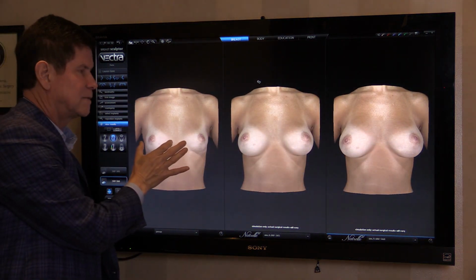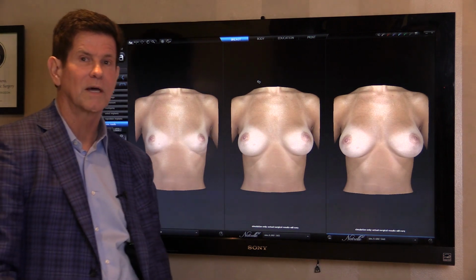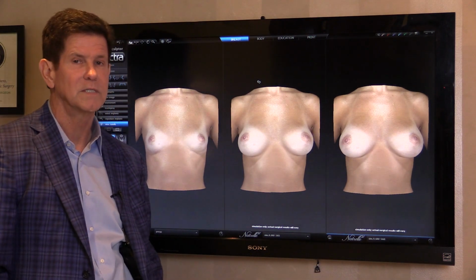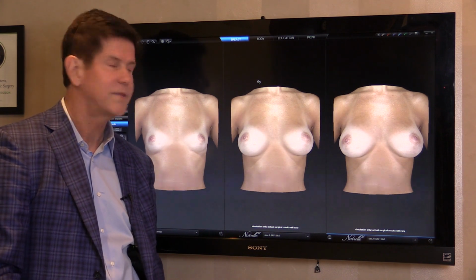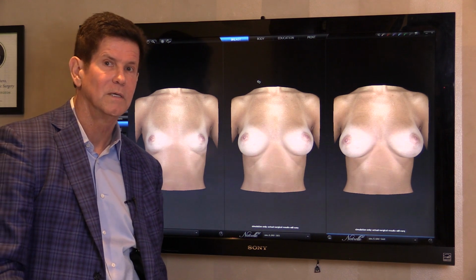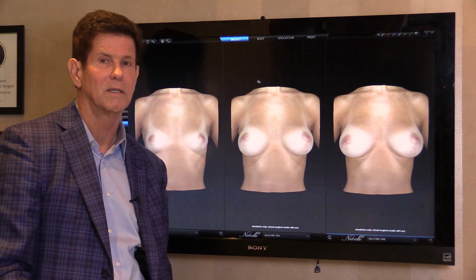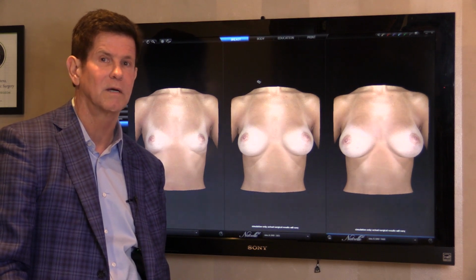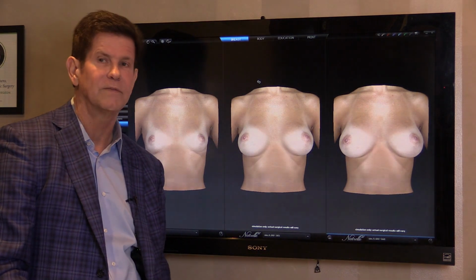What's the best fit for her breast? What's just right? We like to say there's a Goldilocks syndrome in breast implants. There are none that are too big, too small. What's just right? Now with that said, some of our patients may want a fuller implant than others. We may want to go a little bit wider for them, but we don't want to go so wide that the implant now looks ridiculous. It's now sitting in her armpit and way up on her collarbone. There truly is a right fit for every woman.